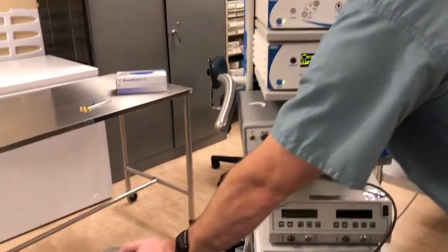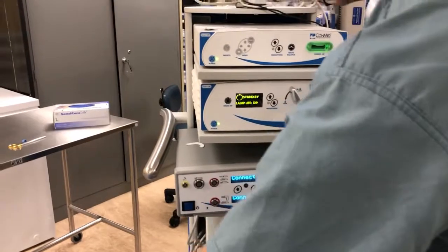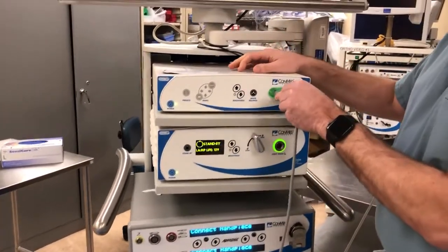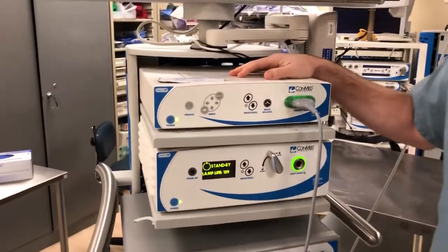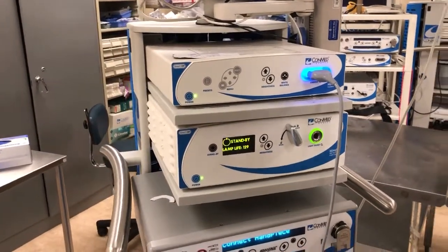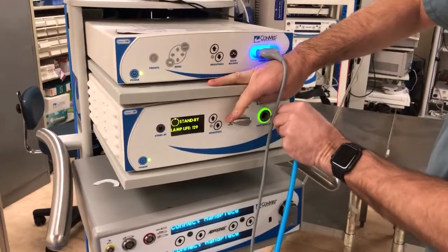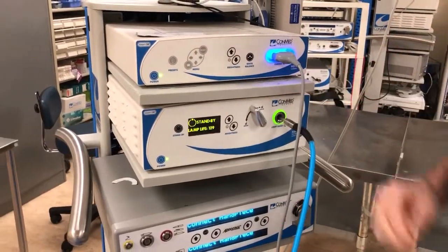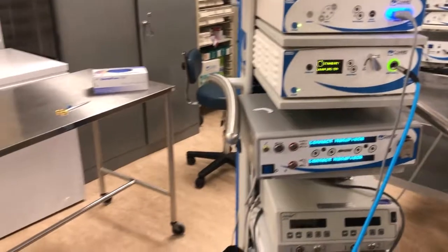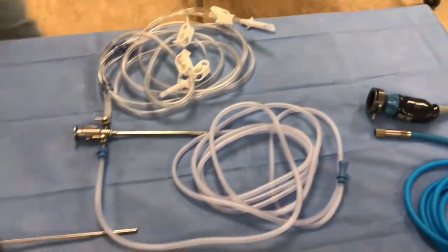The first thing we're going to hook up is our arthroscopic camera cord — it just slides in. The next thing is our light source. Then we'll come back over to the table and assemble the remainder of the arthroscope.